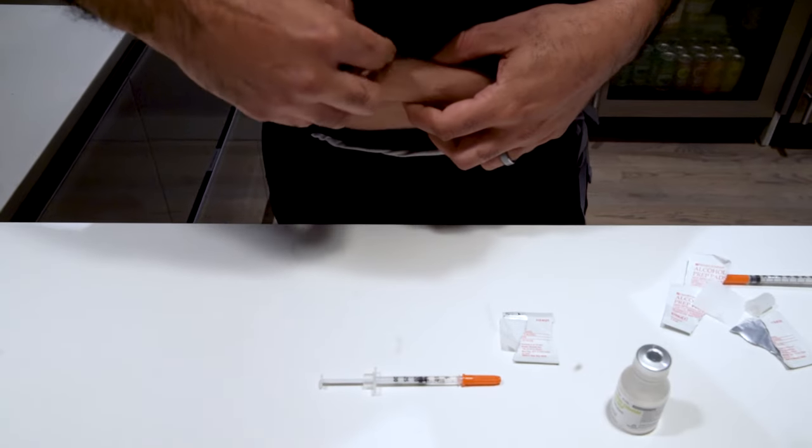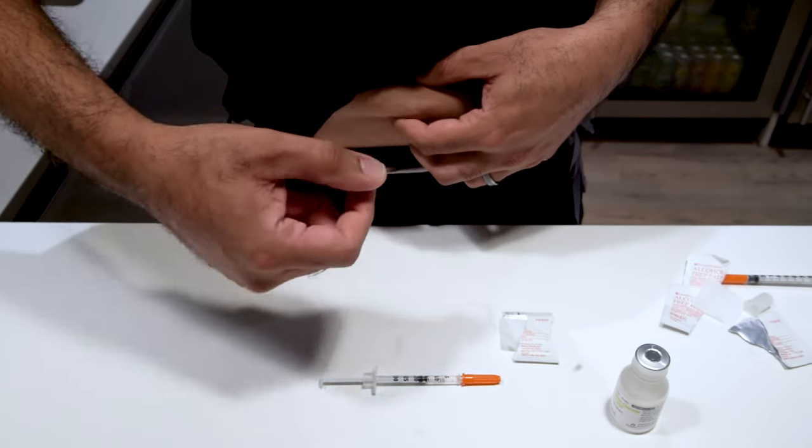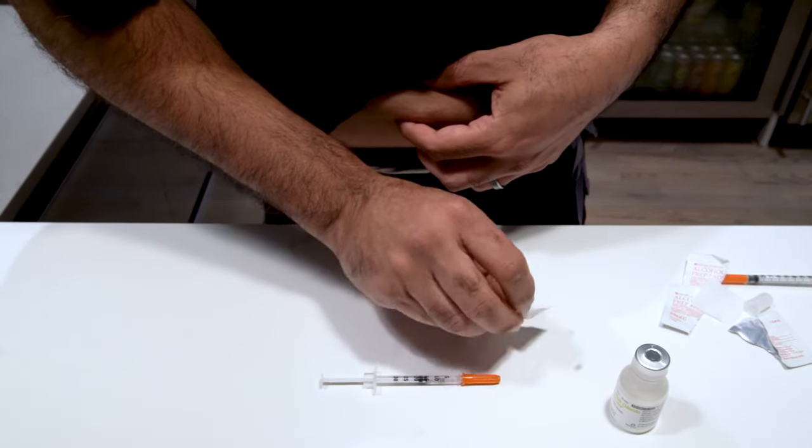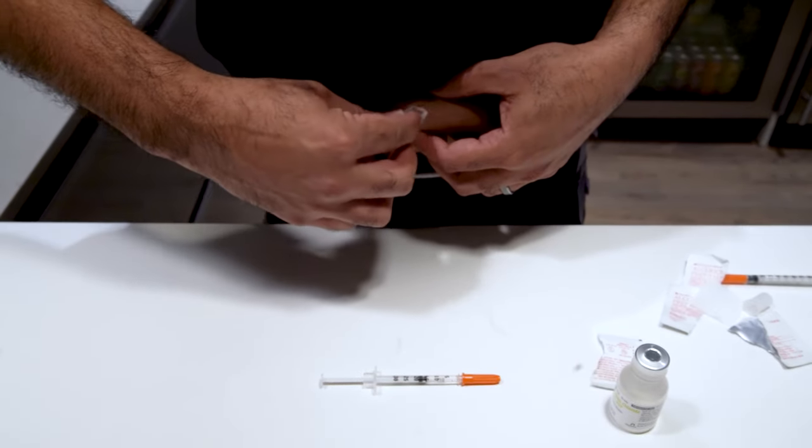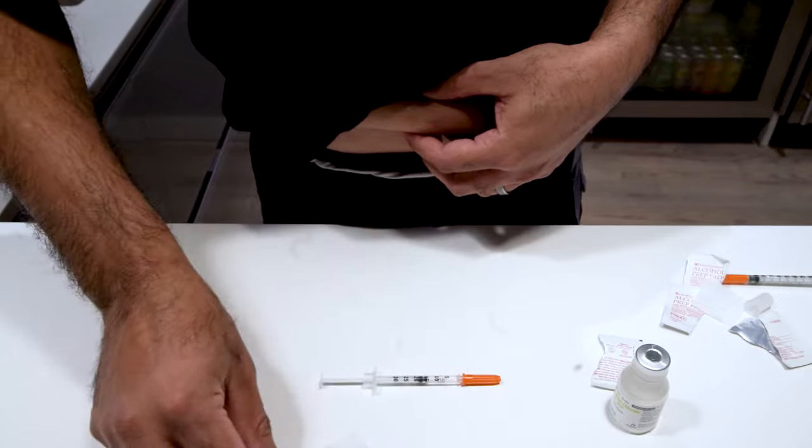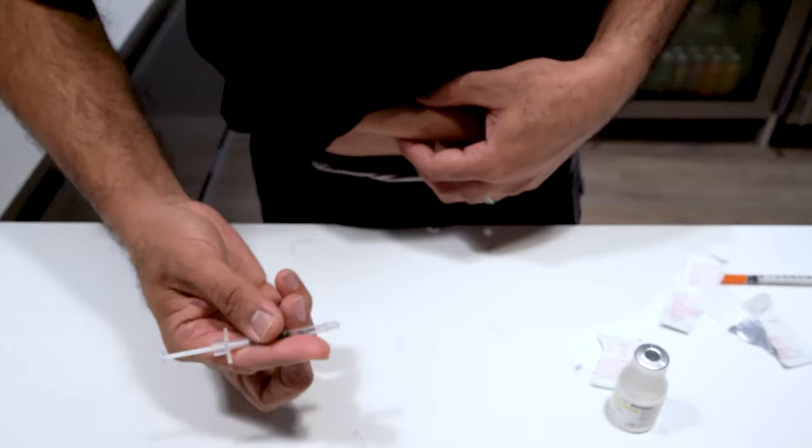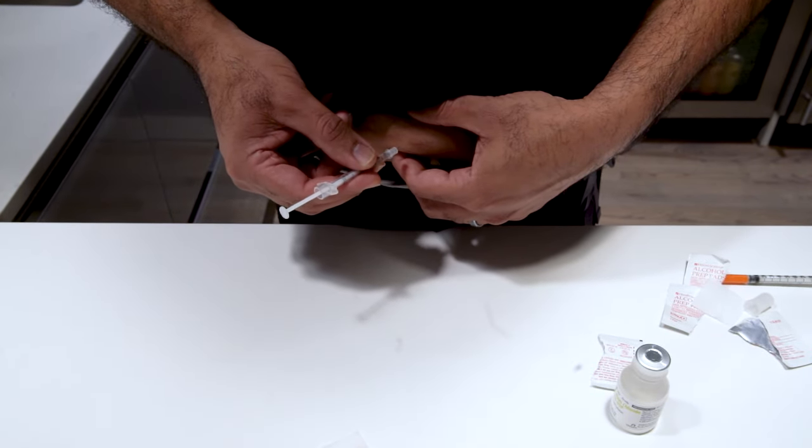I'm going to go ahead and pull up my shirt here. I'm going to grab a pinch of my skin. I'm not going to squeeze too hard because I don't want to inject under pressure and accidentally get this medication back out, so I'm just kind of grabbing my skin lightly. Grabbing the rest of the alcohol pad, cleaning the area. Getting my syringe ready, taking the cap back off. And I'm just going to put this needle kind of close to my skin where I have it nice and stabilized.